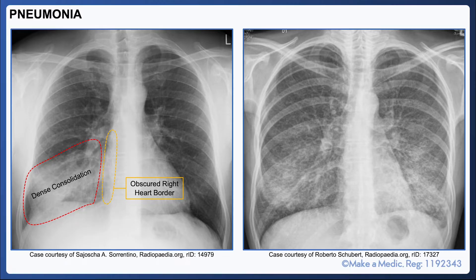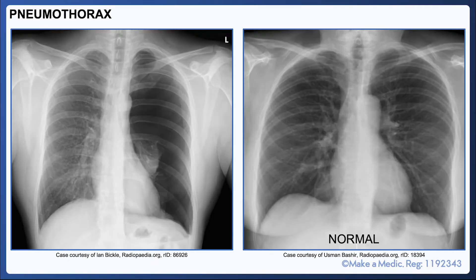In other forms of pneumonia, particularly atypical pneumonias, you may note a more widespread opacification of the lung parenchyma. Pneumothoraces are often small and can sometimes be difficult to identify. In this case, the patient has a massive pneumothorax and you can clearly see that there is an absence of lung markings on the left side.